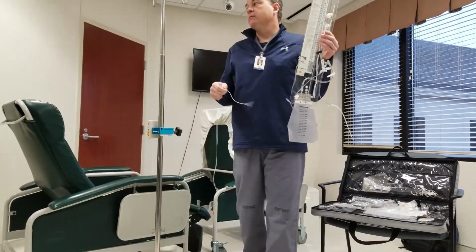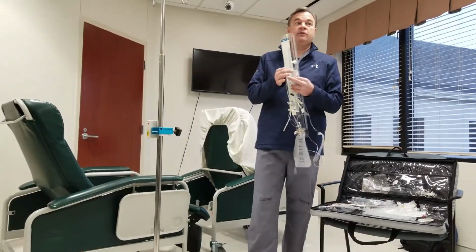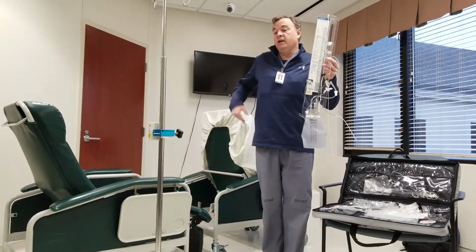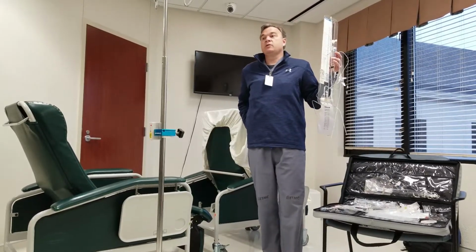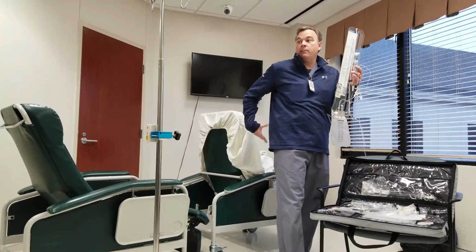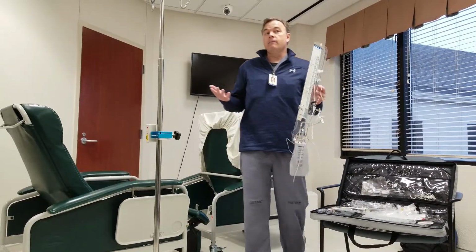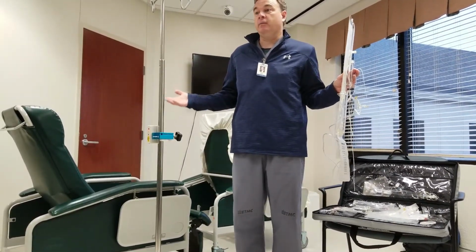Typically the patient will come with a Foley, because standing up is counterintuitive for both the drain and for the patch. All that pressure in your spinal canal pushes down due to gravity, and now you get a patient having unbelievable positional headaches. They stand up, the room starts spinning, they have a headache like they've never had before, because that pressure is now opening up either the drain, which could happen, or the patch where they have a dural defect. So for the most part, someone will have a Foley in, and they're not going to be ambulatory and whatever else.